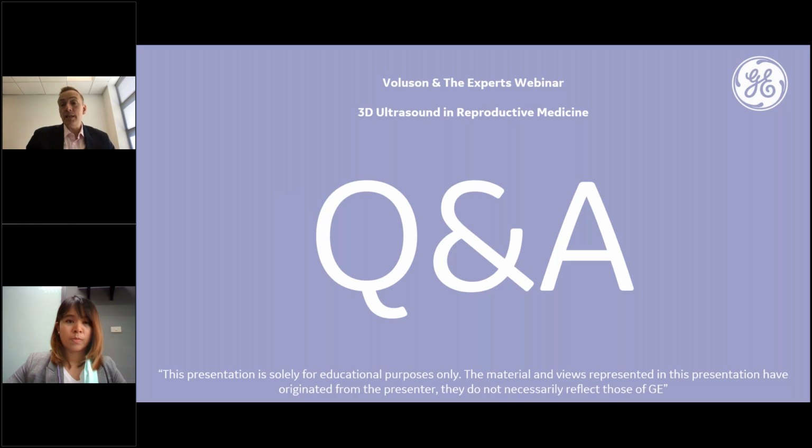I then would do a 3D picture, and I'd apply the same concept. You can modify SRI, you can modify the gain on a volumetric data set as well. And then I render the image, because rendering gives you that ability to show depth. And hopefully I showed my World Cup fibroid, my golden one, how the first image was terrible, and yet at the end it was crystal clear. If you're still struggling after maximizing 2D, after acquiring a 3D volume and rendering it, then use some saline, because saline just gives that contrast and it allows you to see clearly. So hopefully that's some help there.